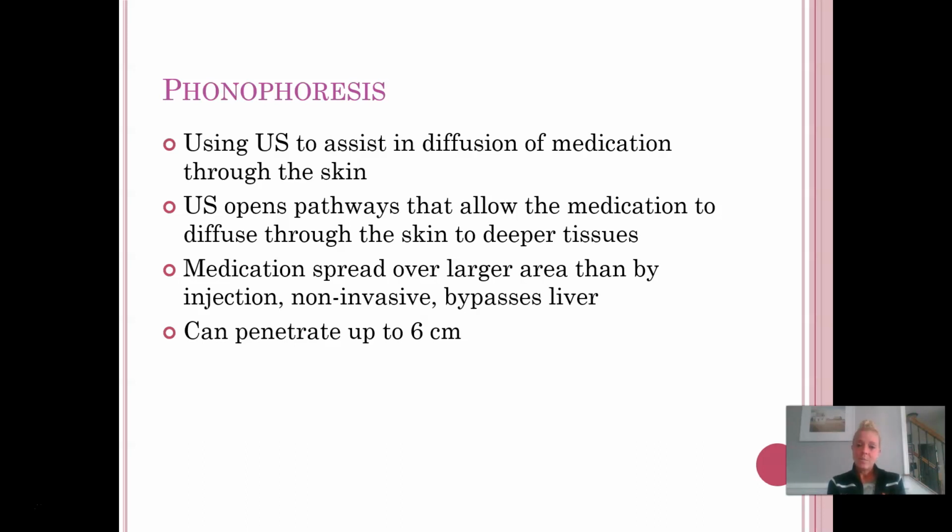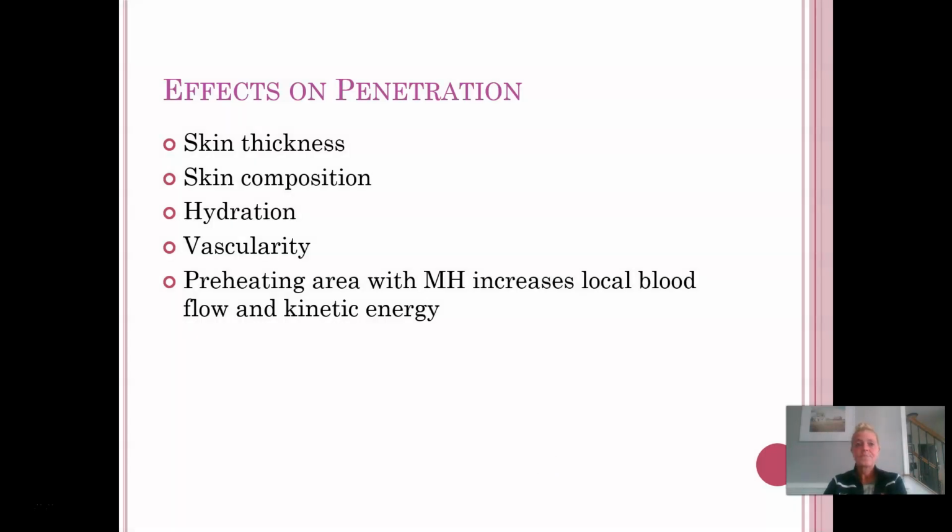With ultrasound, we can penetrate up to about 6 centimeters with the medication. Some things that will affect the depth of penetration of medication using phonophoresis are the skin thickness, so it's difficult to treat areas of really thick skin, composition, hydration, and vascularity, which we really don't have any control over.